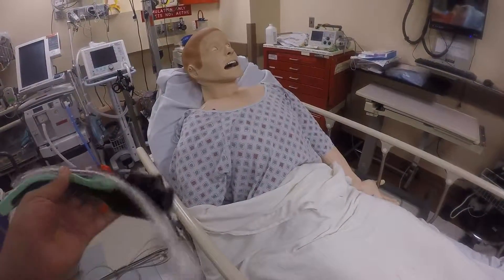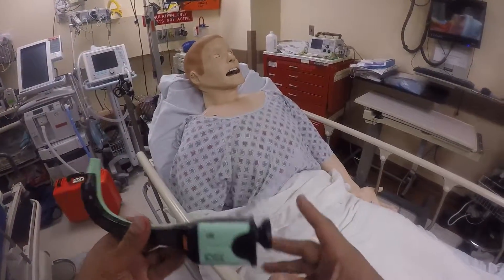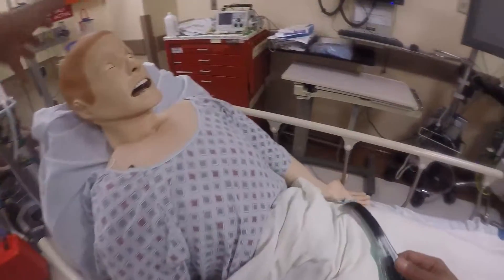People consider it video, but it's not. It's basically plastic with lenses, designed by Pedro Archa — a very ingenious idea. The channel does much of the work.